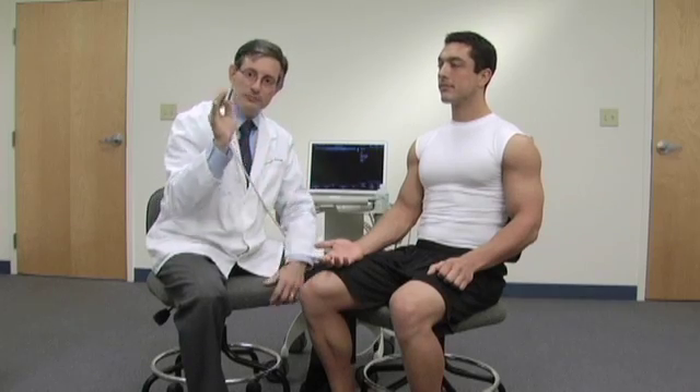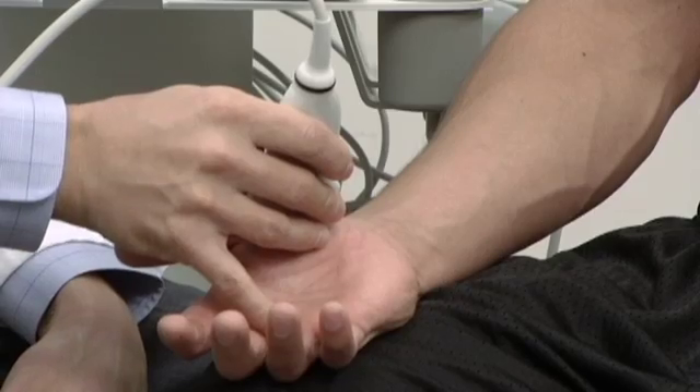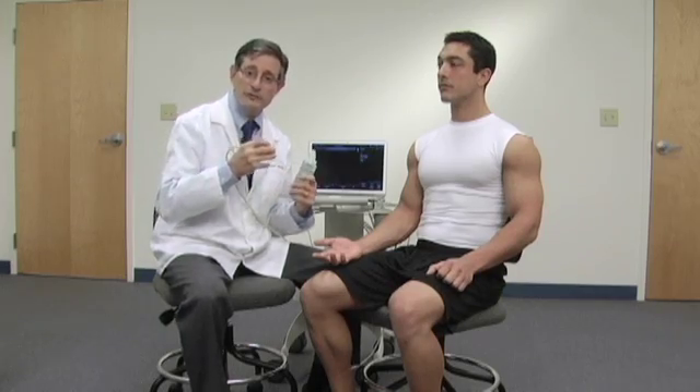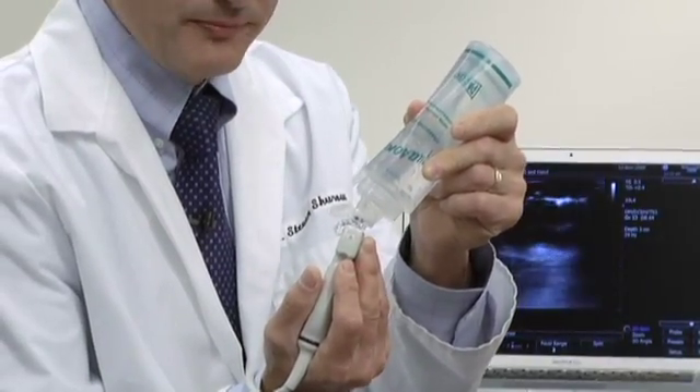The proper way to hold the probe is a bit like a pencil — you're going to hold the probe something like this. When you place the probe on the person, try to place at least one or two fingers down on the patient to stabilize your hand. We also need to use adequate amounts of gel in order for ultrasound to penetrate the skin, so make sure to apply plenty of ultrasound gel either to the probe or to the patient.